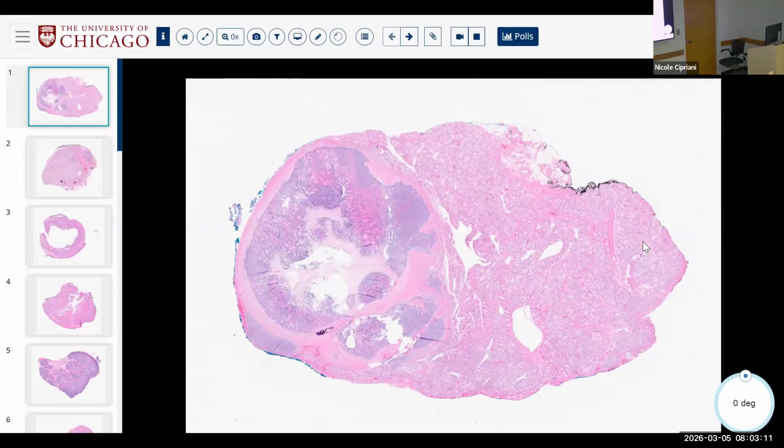I don't have, unfortunately, any of the gross photos here, but one of the concepts that we always want to think about when we're grossing thyroid is, do we see any evidence of gross invasion? Infiltrative borders, satellite nodules, sclerosis, et cetera. In this case, you may not have seen that because it's small and it's relatively circumscribed, but there's a peripheral collagenous fibrous band, and there are areas of tumor that are overtly on the outside of the band that push into the normal thyroid parenchyma.